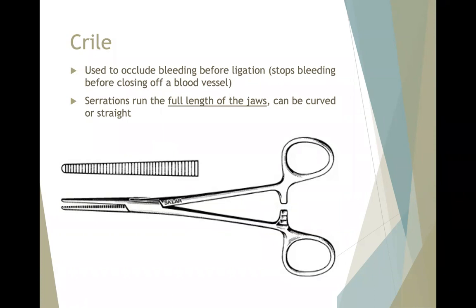And it can actually close off the blood vessel. Sometimes you need to place sutures, but if the jaw is locked long enough, sometimes the tissue will just adhere to itself. Again, we use this to stop bleeding.